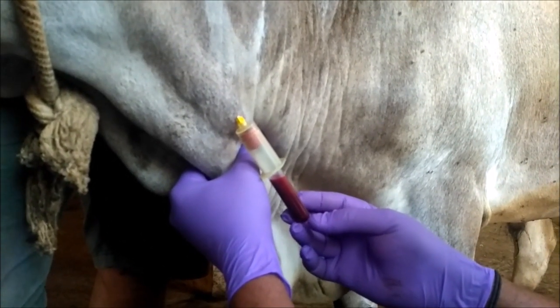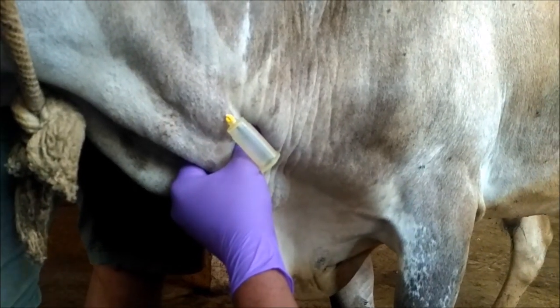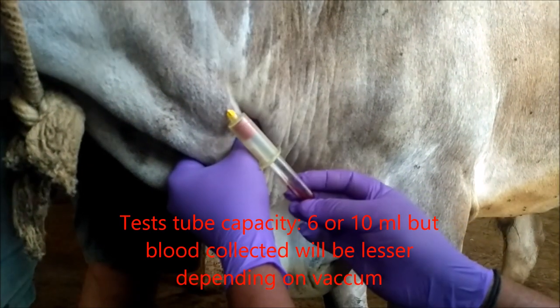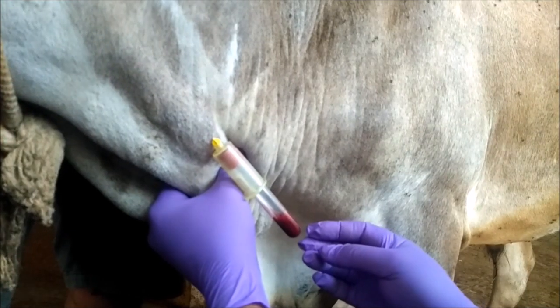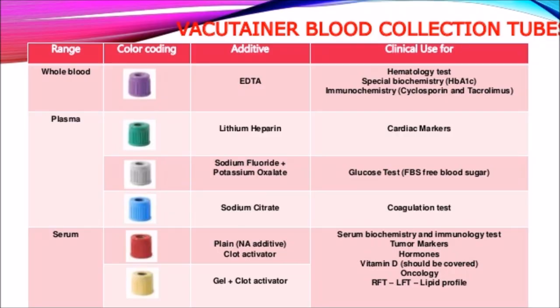The quantity of blood collected in the test tube depends upon the type of test tube and its capacity. Some test tubes have 5 ml, others 10 ml. The type of blood you want determines the color of the test tube cap.